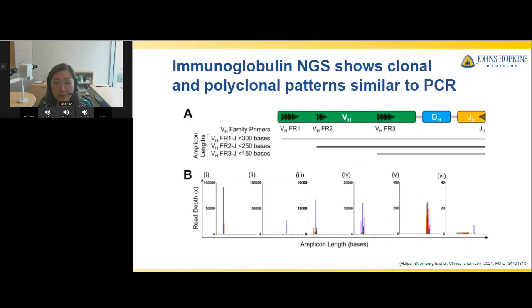And here are some representative clonal patterns derived from duplicate reactions from a study that we had done. So remember the design is on the top. The first panel here shows you a clonal signal that's actually biallelic. The color codes correspond to the specific VJ genes that are used. In this case, a different VJ combination is used for that second allele. Now, obviously there was amplification bias here. We talked about amplification bias previously. There's clearly amplification bias, right? Because these two, while being biallelic from the same cell, do not amplify at the same rate. The second example is a clear clonal monoallelic example.